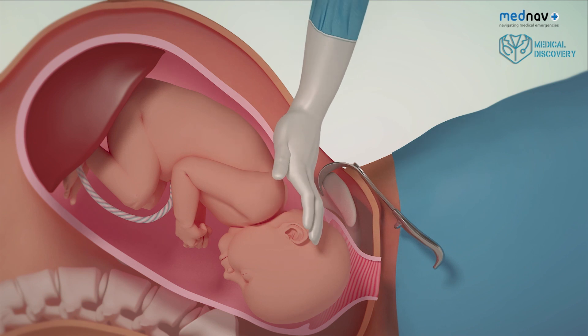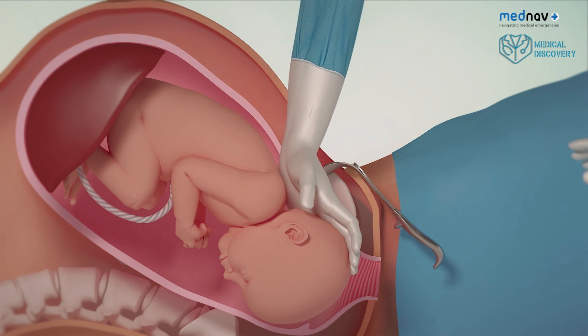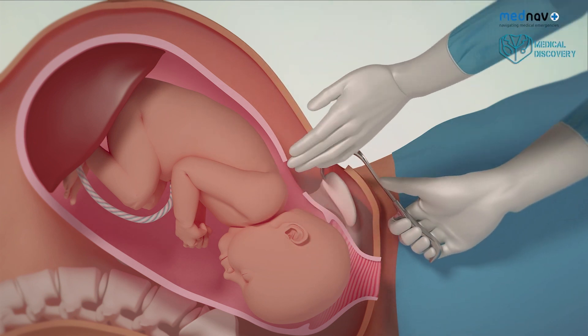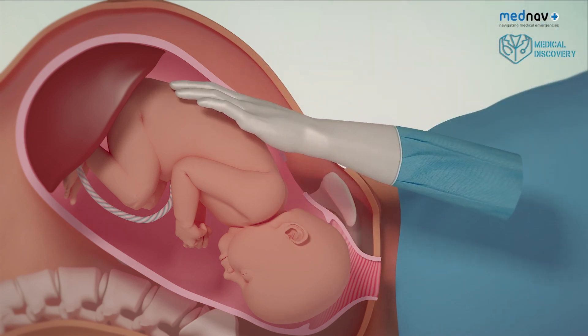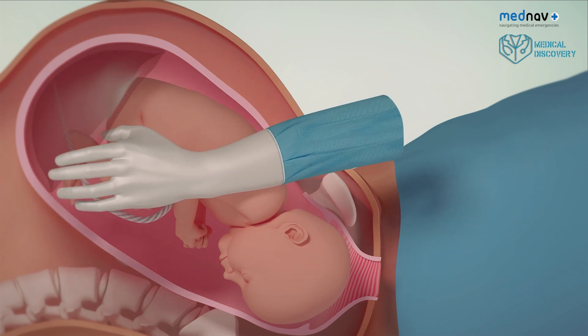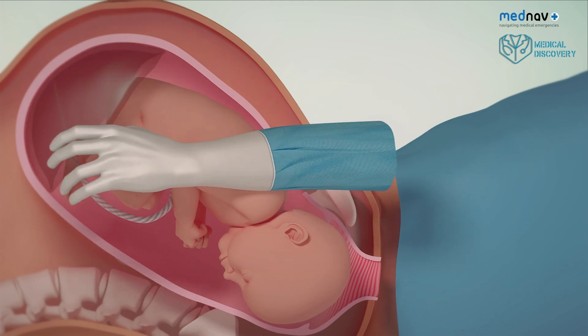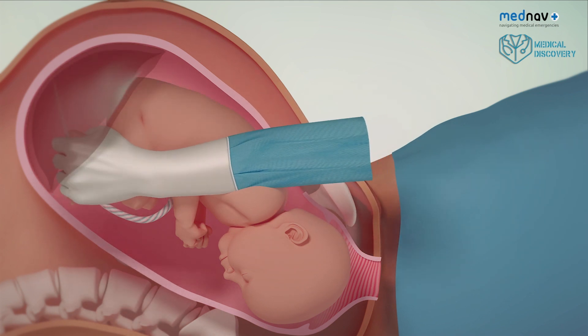Reverse breech extraction. Find a foot or both feet and deliver the baby by breech. A T or J incision may be needed for access.